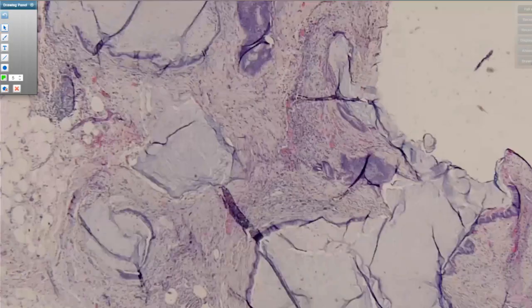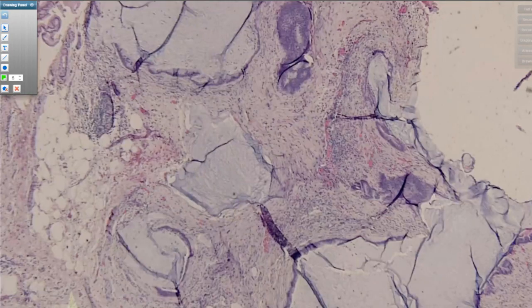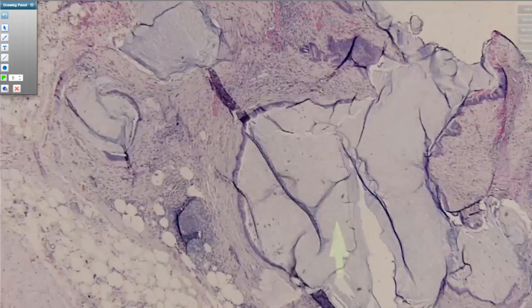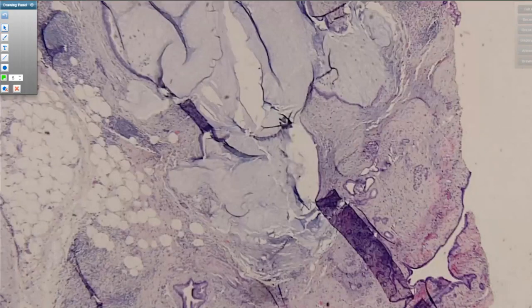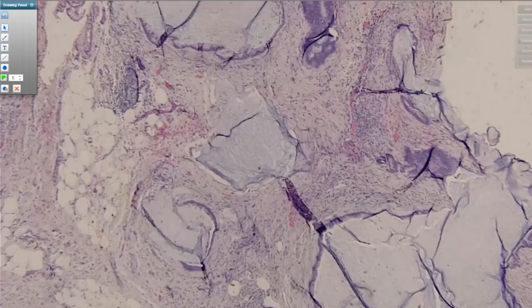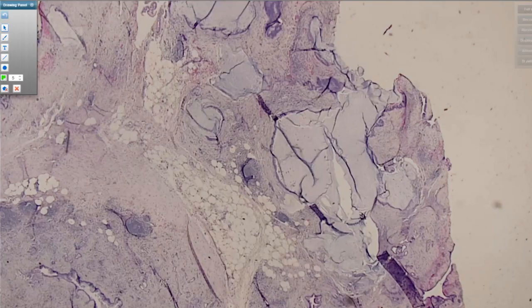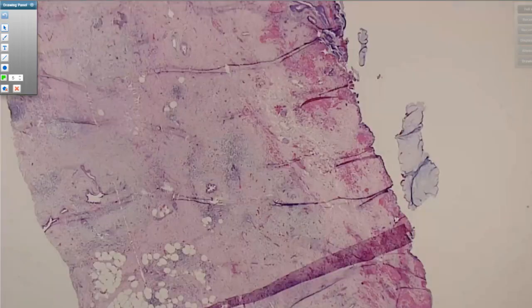Again, in lots of other areas, it's somewhat incompletely lined glands, mucin that's starting to track out towards fat, which again, the pancreas doesn't always tell you much because you can get fat scattered throughout, but just enough that this is a cyst that's making you uncomfortable, right? It's doing a lot of things that are suspicious, but not fully diagnostic. What I really like to see to definitively call invasion is at least 4 or 5 angulated small glands with desmoplasia off to the side of the IPMN that doesn't seem like it could possibly fit into a normal duct architecture. So that's 1.